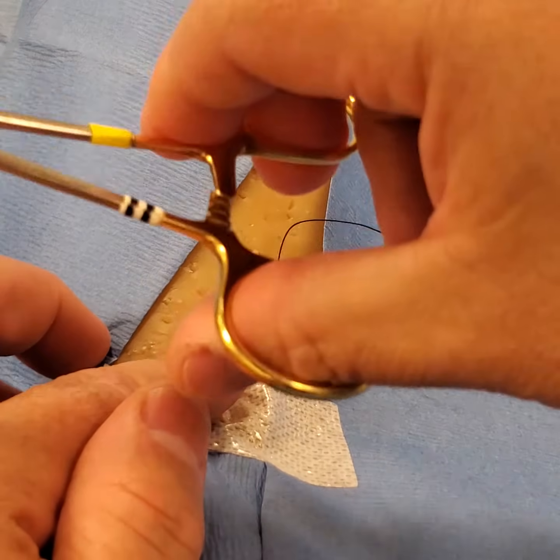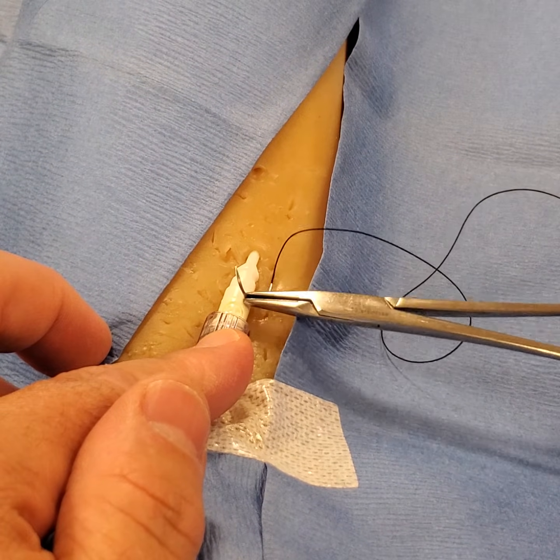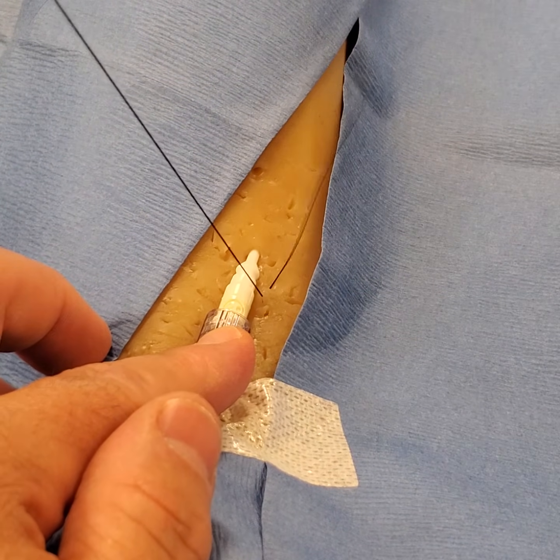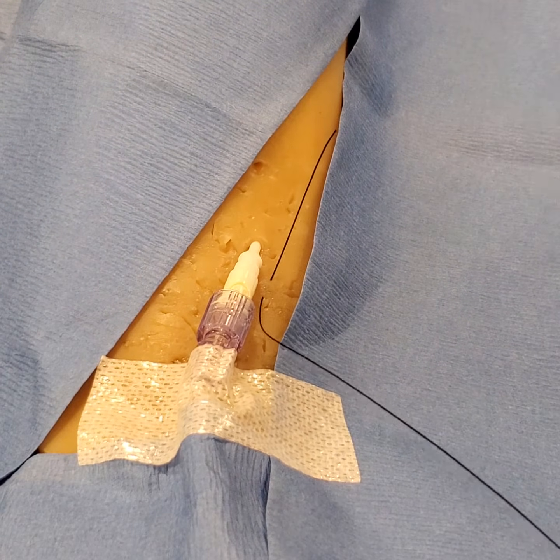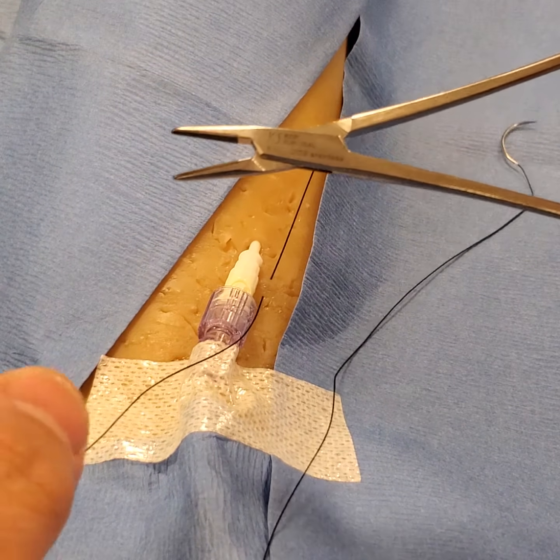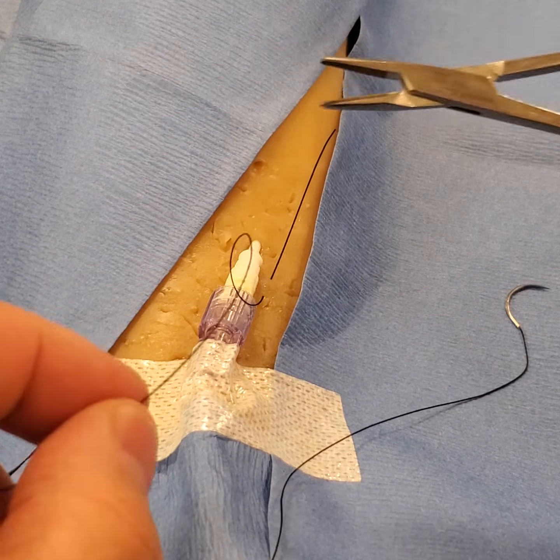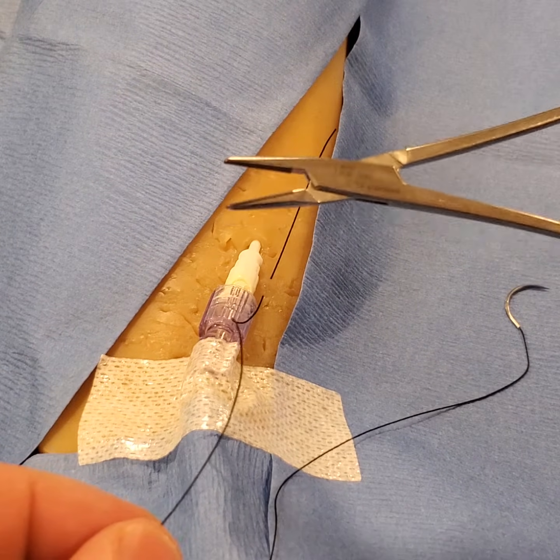Notice I'm not locking the needle drivers in — that makes it easier to open and close. Pull it, give yourself a couple inches, drop the needle, keep your needle drivers open, and then create three knots in descending fashion.